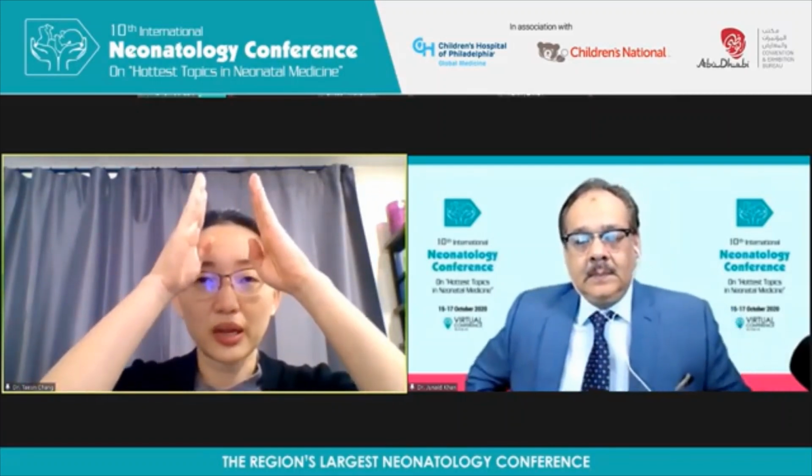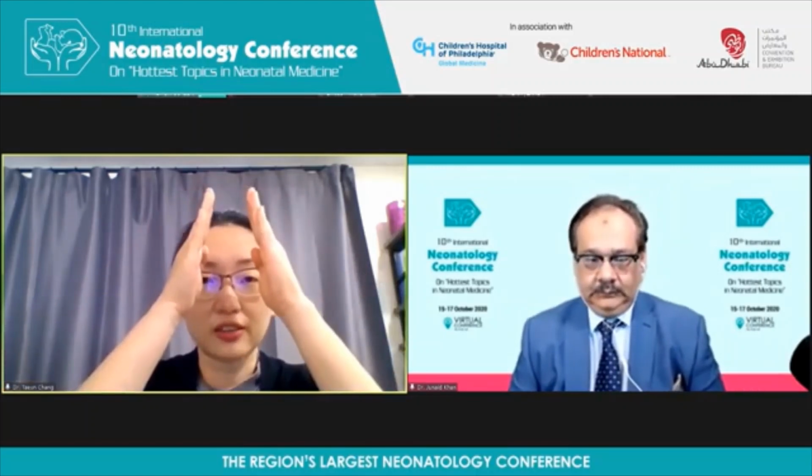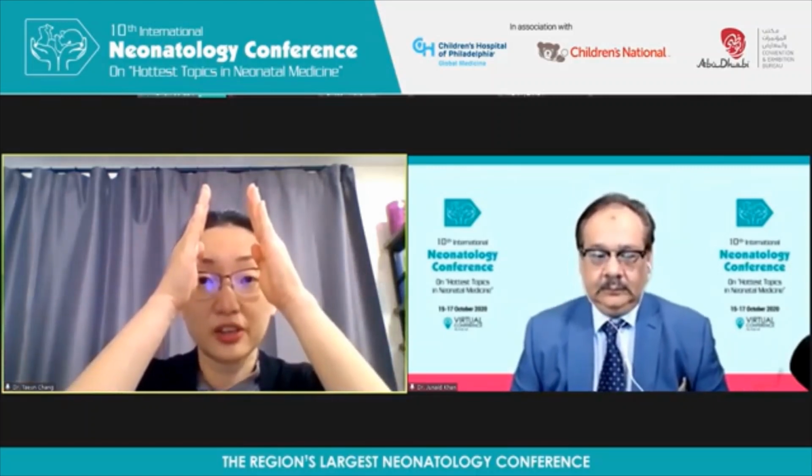And I think our head of radiology is actually one of the forerunners of doing neonatal head ultrasounds. And oftentimes what happens is head ultrasounds are done very poorly. You're not using the head ultrasound to its maximum capacity if you don't recognize that you can open up the windows of that transducer so that it's not just looking at the ventricles for IVH, as if IVH is the only brain problem a newborn has, but open up as wide as possible so that you can see as much of the brain, and not only side to side, but also open up the window all the way down so that you can see the whole posterior fossa.